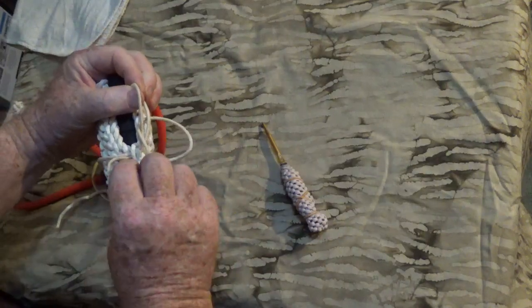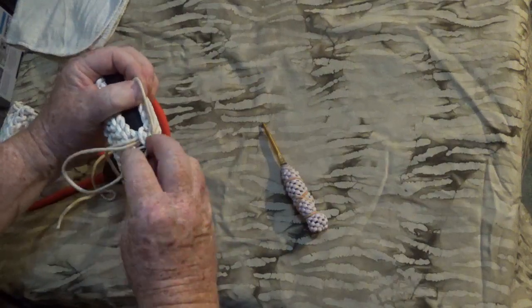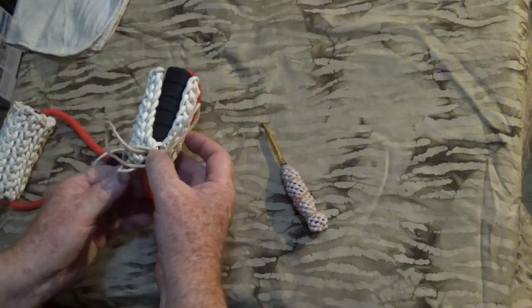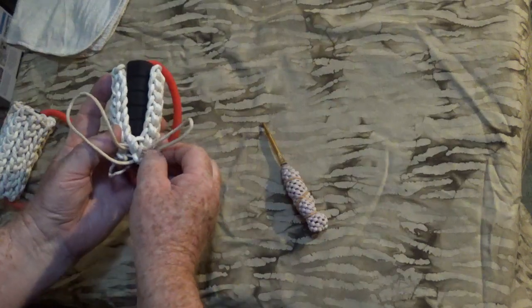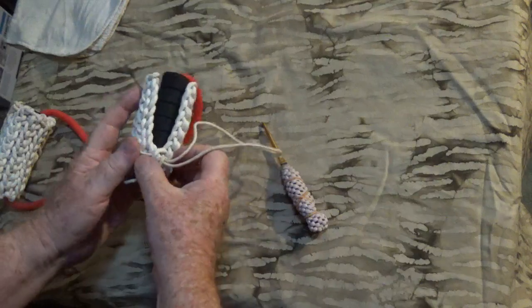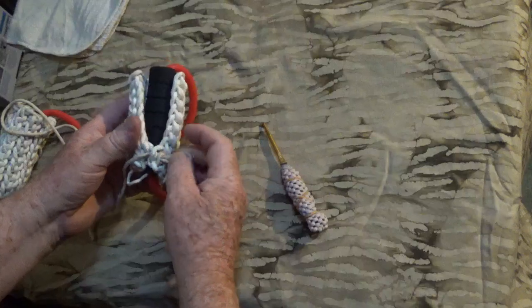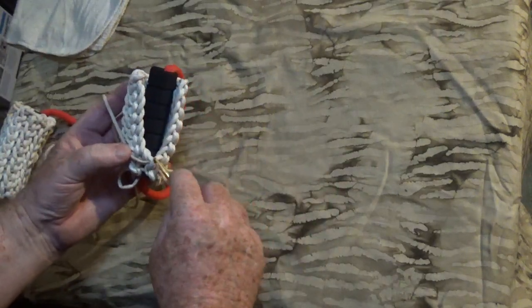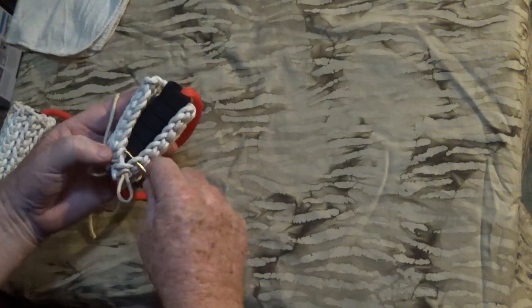And then this bottom represents the running end of the first loop. We tighten it around. It tightens around that cord. And then we're going to pull the bottom of this new second loop, tighten it up, bring it down to a comfortable diameter, or comfortable size of a loop. And then we're going to go up to the next 2 loops of the handle that we're making.